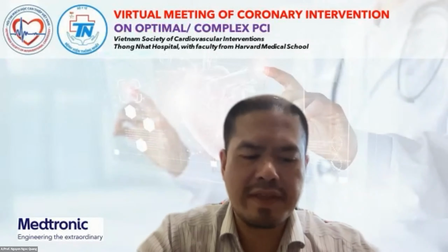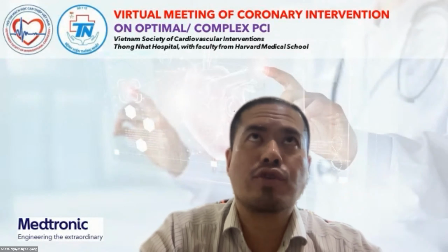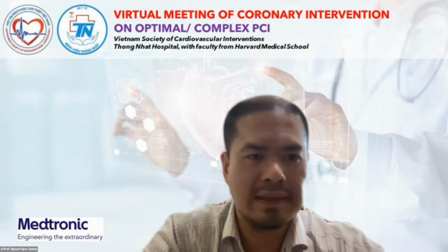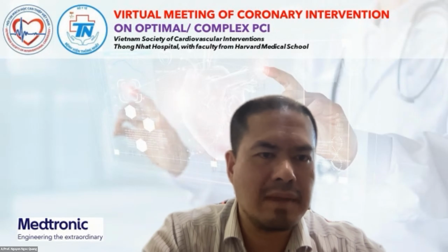So what about you, Professor Tech? Can you give us some ideas of what the trend of intravascular imaging in the US is? Please unmute, Professor Tech.